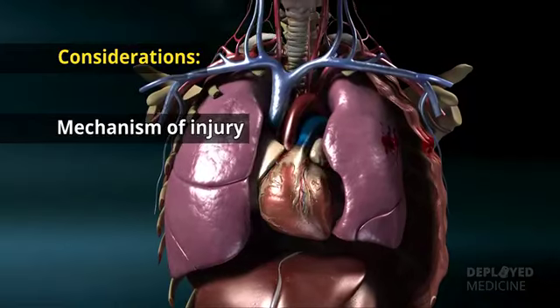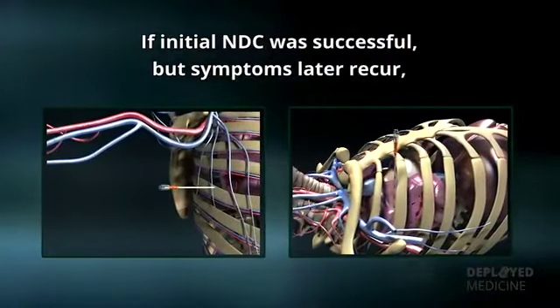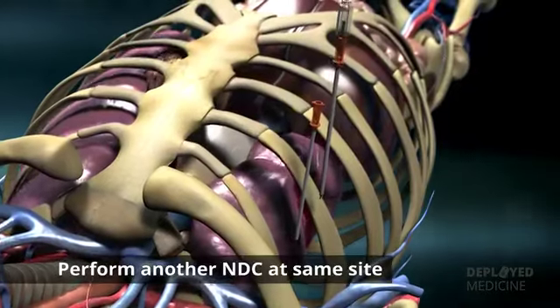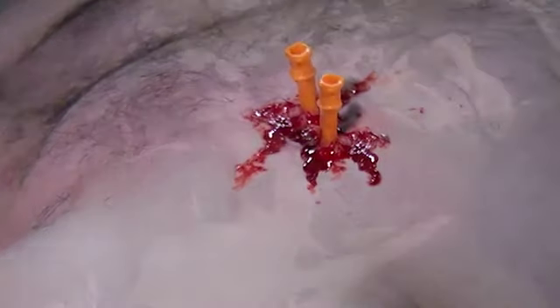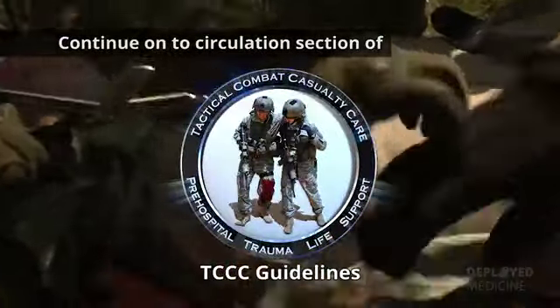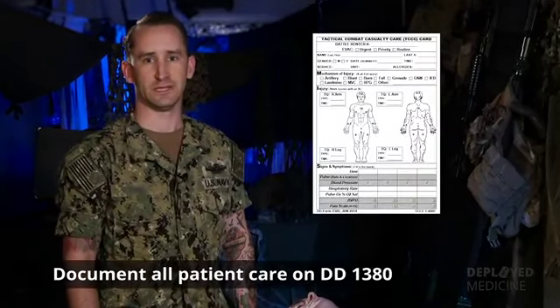Consider, based on the mechanism of injury and physical findings, whether decompression of the opposite side of the chest may be needed. If the initial NDC was successful but symptoms later recur, perform another NDC at the same site that was used previously. Use a new needle catheter unit for the repeat NDC. If the 2nd NDC is also not successful, continue on to the circulation section of the Tactical Combat Casualty Care TCCC guidelines. Continue to reassess for redevelopment of a tension pneumothorax and document all care on the DD Form 1380.